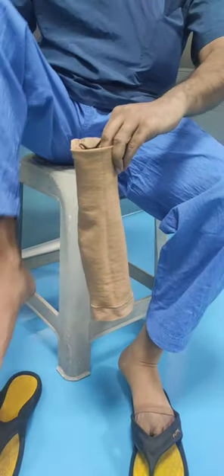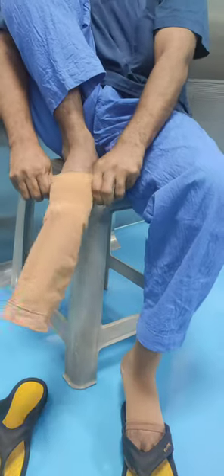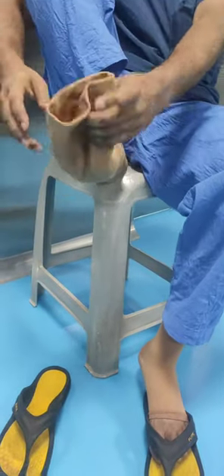Then hold the heel sack folds with two hands and pull up to the level of the ankle. Make sure the heel sack is on the outside.